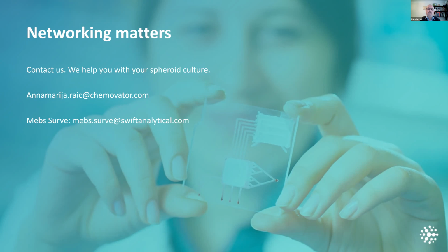Francesco asks, when we generally coat plates with agarose to prevent cell adhesion, some agarose may be present in suspension, creating undesired debris. Does your coating solve this issue? Yes. So we saw that with our coating, it's possible to generate one spheroid without aggregates. But if this is not possible, which maybe happens for primary cells or hard to culture cells, you can also centrifuge the plate, and that improves the spheroid formation.